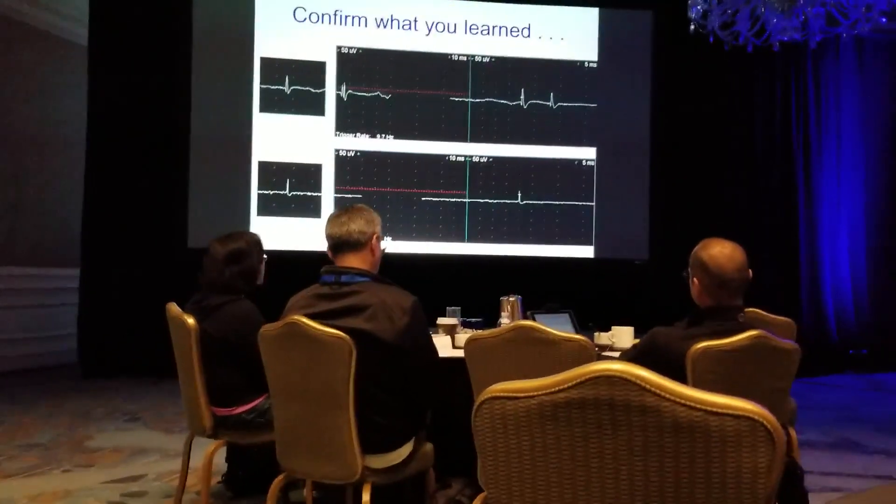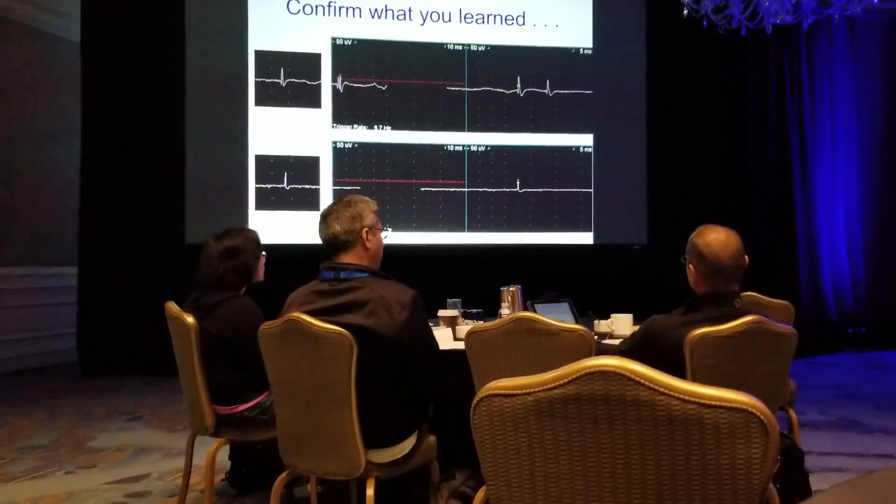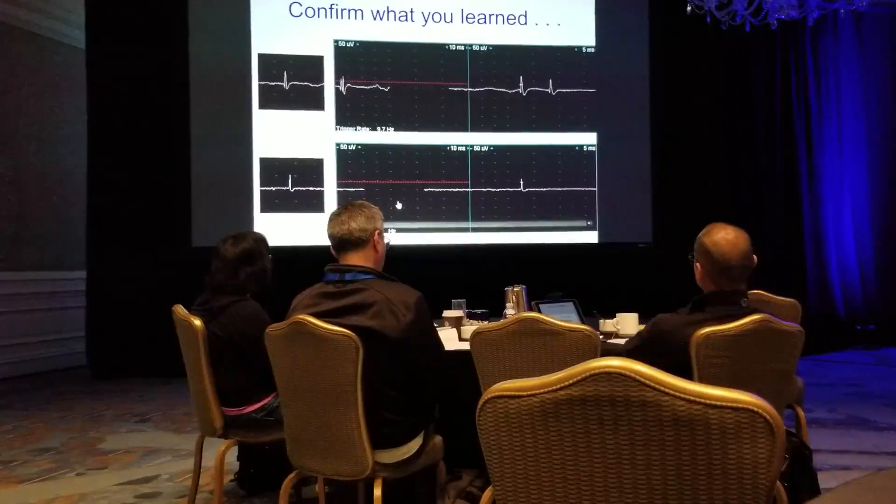What's the firing pattern? Irregular. What is that? End plate spike.